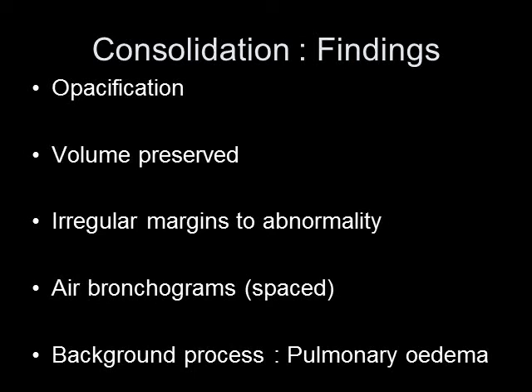Air bronchograms are the cardinal sign of consolidation. The small airways in the lung are not normally visible on CT or chest X-ray because they are filled with air and are black against the black background of the alveoli. However, when consolidation occurs and the alveoli become white due to opacification, the small airways remain black as there is continued air movement. We can therefore see air bronchograms — the photographic negative of a bronchus filled with air against a white background of consolidation.